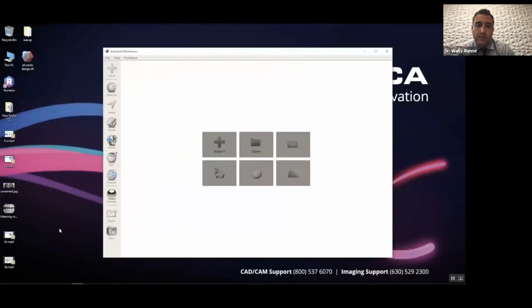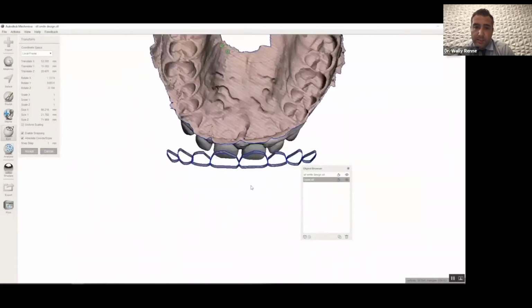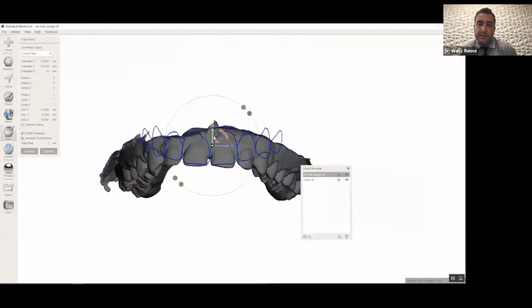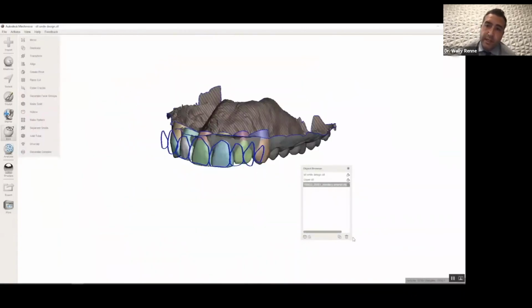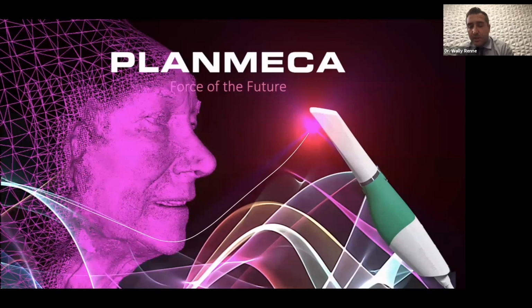Okay. So this is just showing you what the STL export of the silhouette looks like, guys. Okay, so once again, that model will be 3D printed and we will do a putty wash that you guys have probably been doing forever, and transfer it to the patient's mouth. Okay, anyway, so, I think I went a little bit too far into the weeds today.